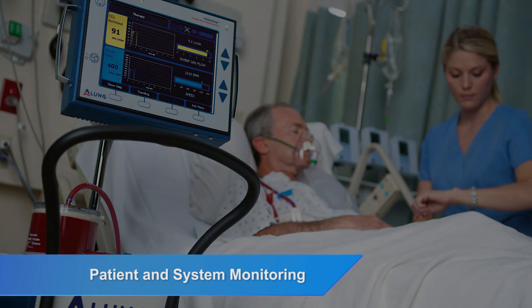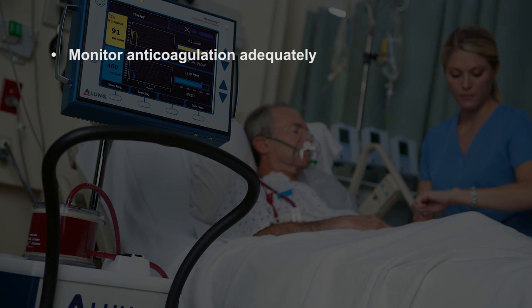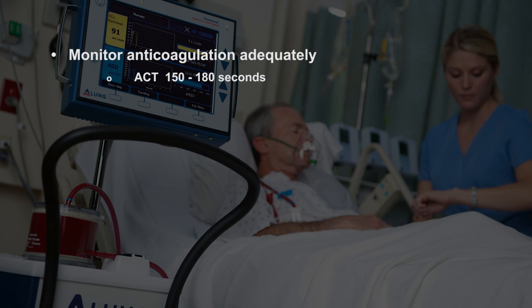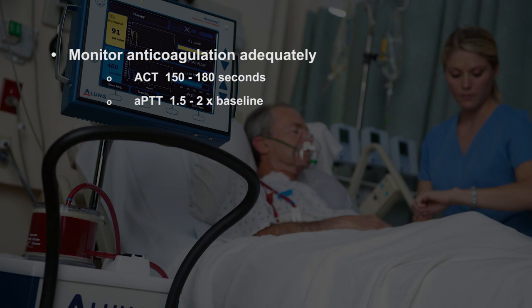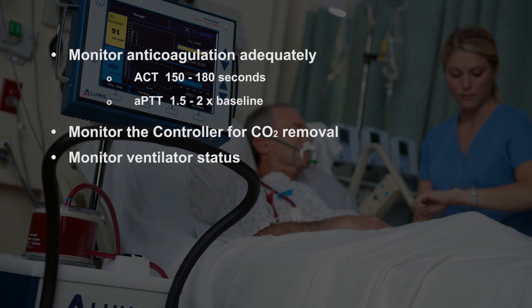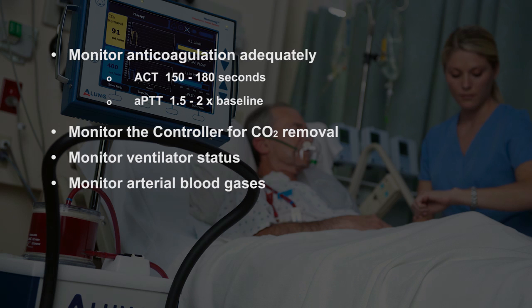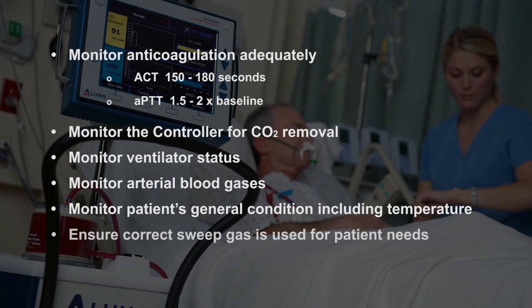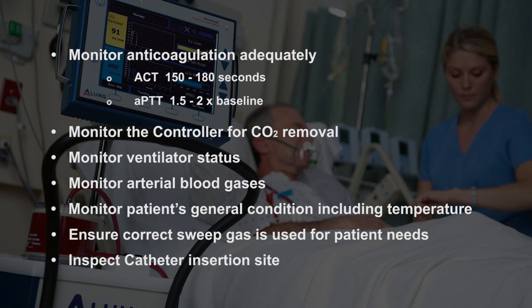Routinely monitor the patient during therapy. Monitor anticoagulation adequately: ACT 150 to 180 seconds or APTT 1.5 to 2 times baseline. Monitor the controller for CO2 removal. Monitor ventilator status. Monitor arterial blood gases. Monitor the patient's general condition including temperature. Ensure correct sweep gas is used for patient needs. Inspect the catheter insertion site.